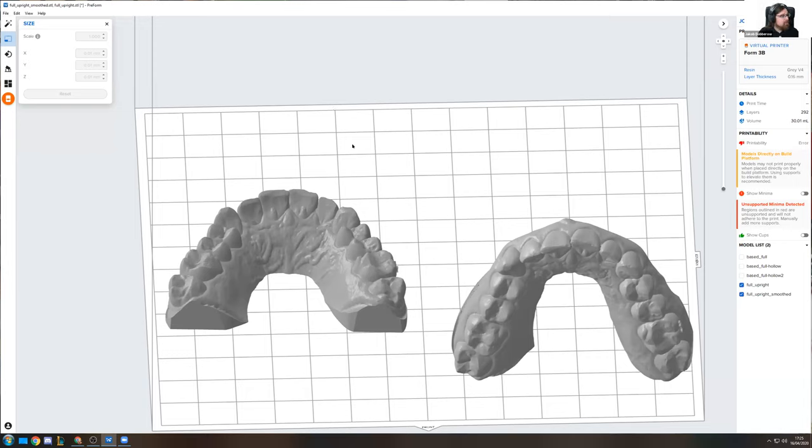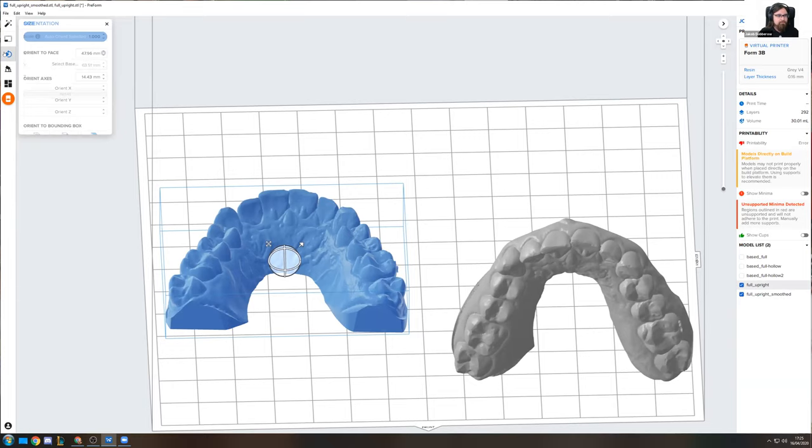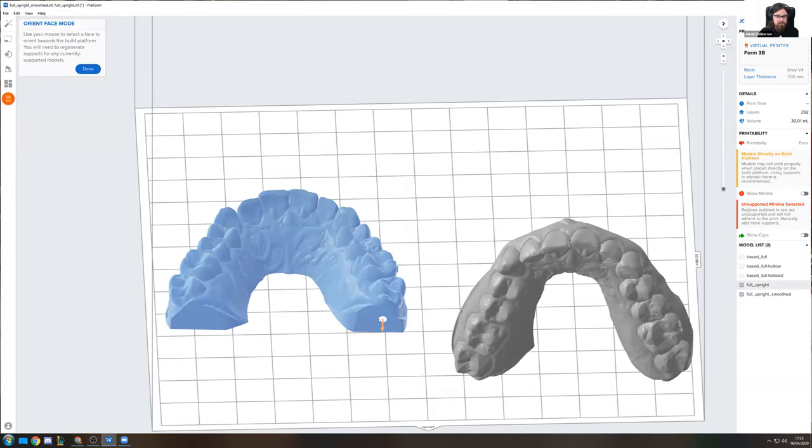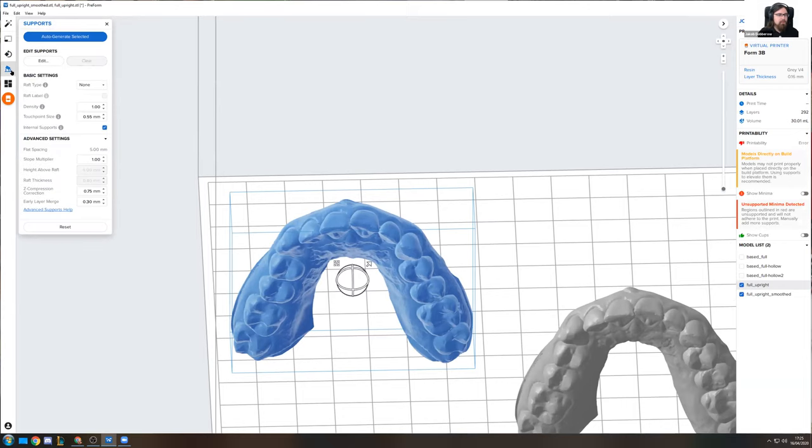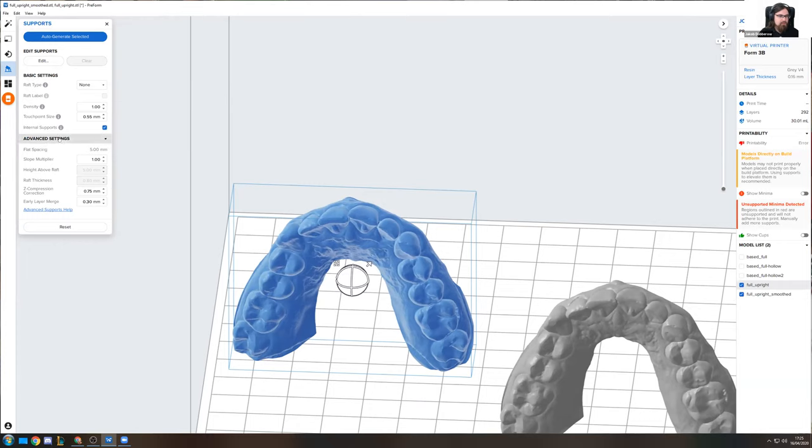And then I see a couple questions on doing different types of supports and how to solve red shaded areas, just to basically go over that real quick again. So let me just very quickly put this model on the backside again. So for this, we would go into the support function right here. And then you can do different types of supports. So the first one is the raft type that you have to select for this type of model where I want it on the build platform, but I still want a couple of supports.